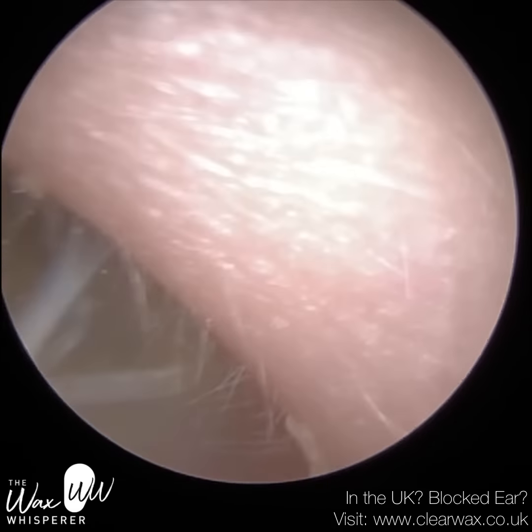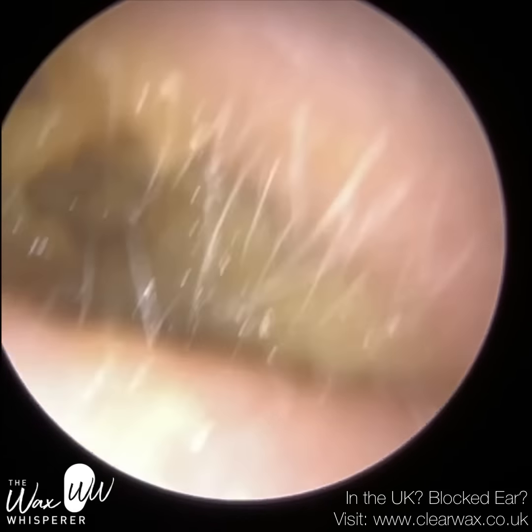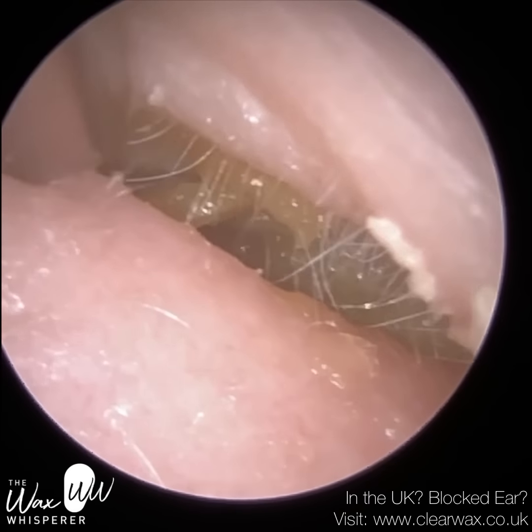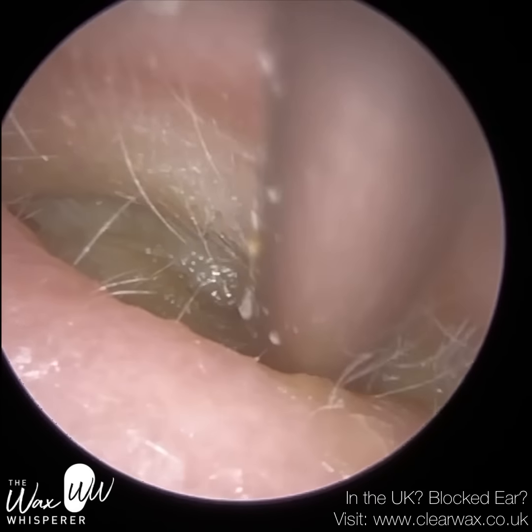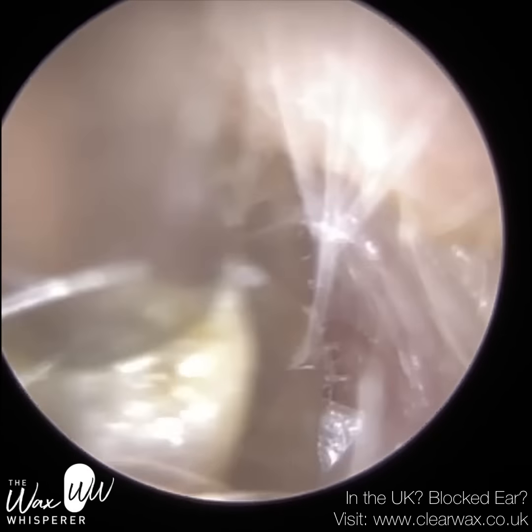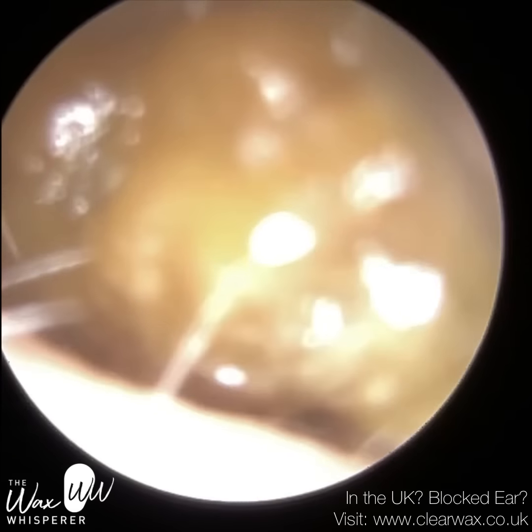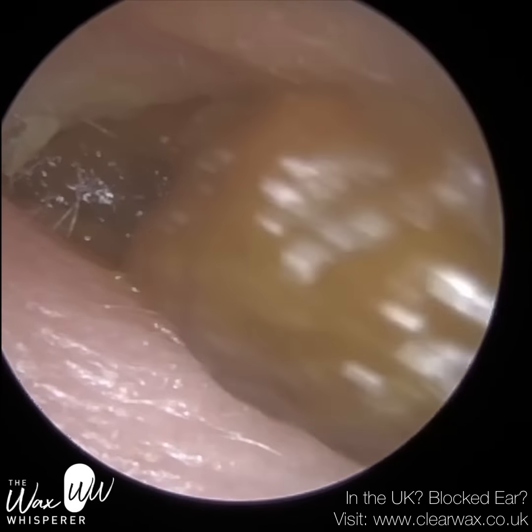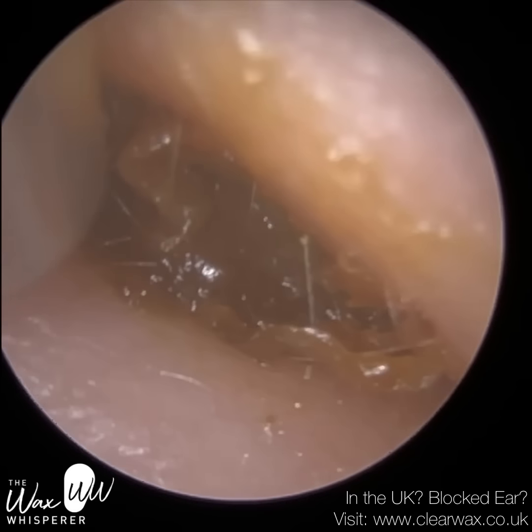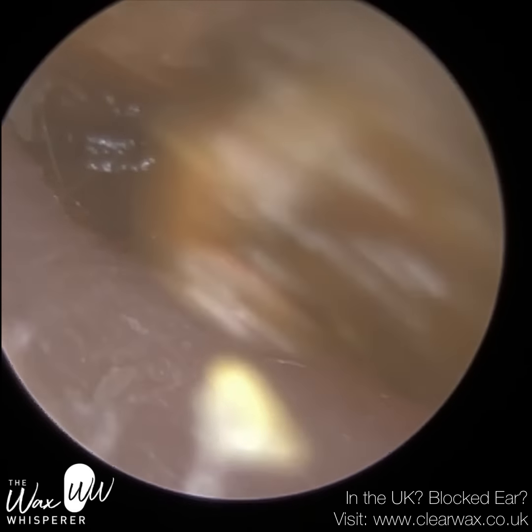I have a very complex case here involving a patient who attended with bilateral fully occluding dead skin plugs and dead skin lining the ear canal. This is their left ear and, believe it or not, the left ear is actually the simpler one. The main problem is that the patient's ear canal entrances are very narrow — they're almost completely sealed. We believe this is because the patient was rubbing their ears a lot near the entrance, as the ears were blocked and itchy, causing inflammation and tenderness.